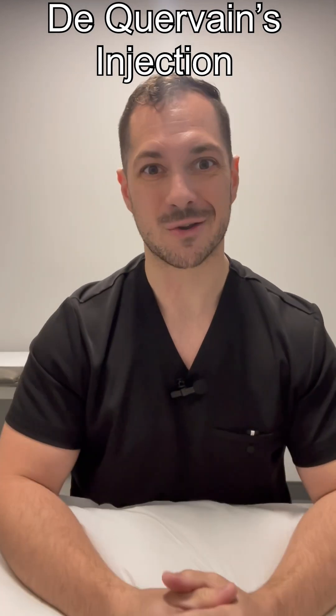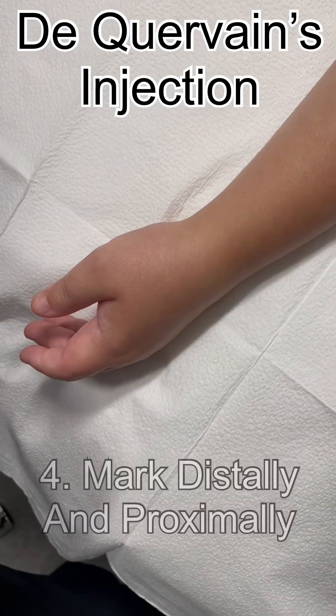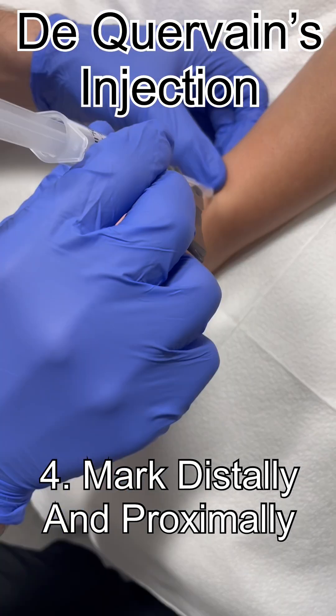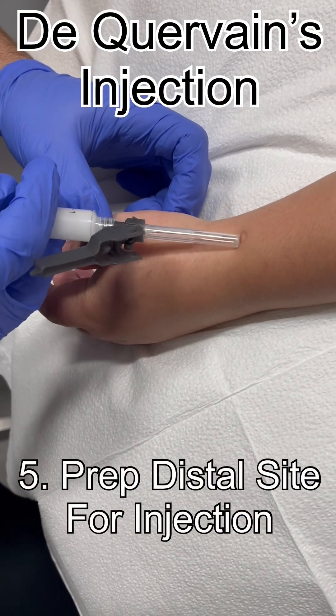That's all there is to it — let's show you how it's done. I'm going to position you this way, face that thumb up, mark where it first starts hurting and mark where it stops hurting. I'm going to put one little mark here, then do the same process from the proximal end — mark just proximal to that. Prep it here and we'll inject and get that whole area.